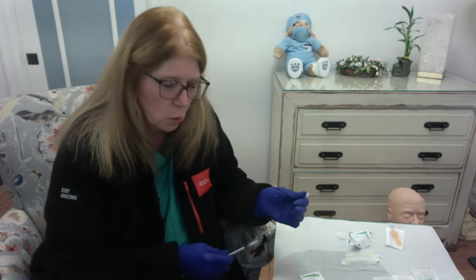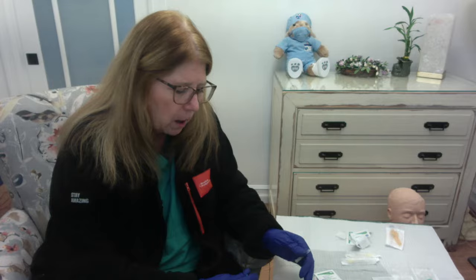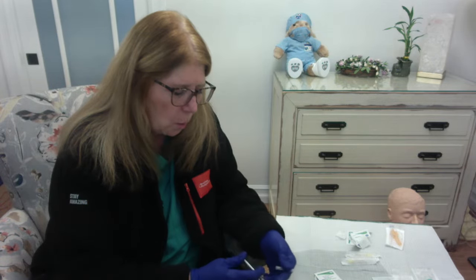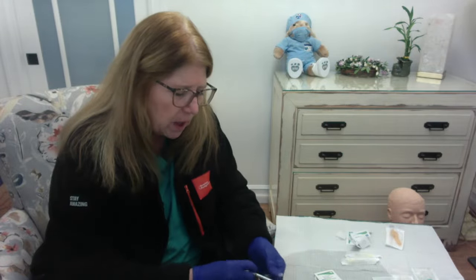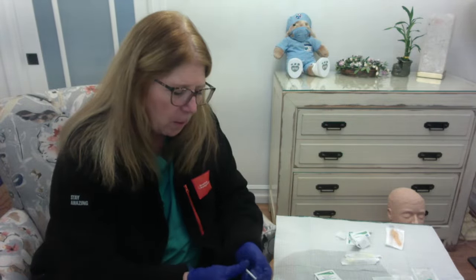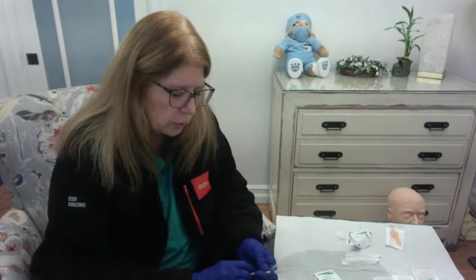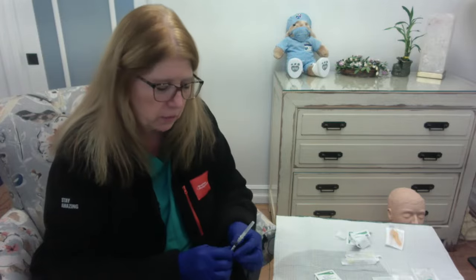I want to make sure that I have this prepared and explain to my patient what I'm doing, and since this is a PPD, we have to talk to the patient about what that means, right, in terms of testing for tuberculosis and what kind of result we are looking for, which of course would be a negative result.